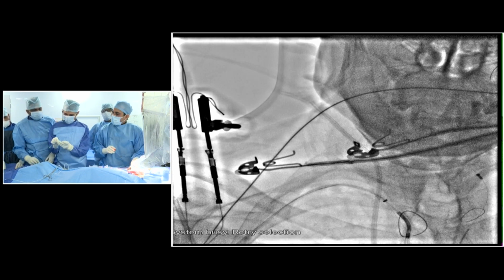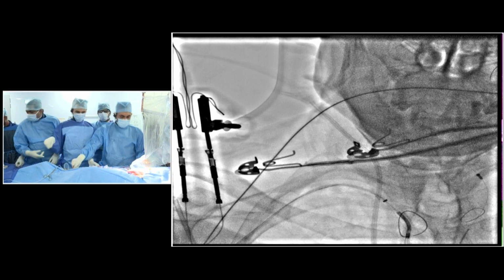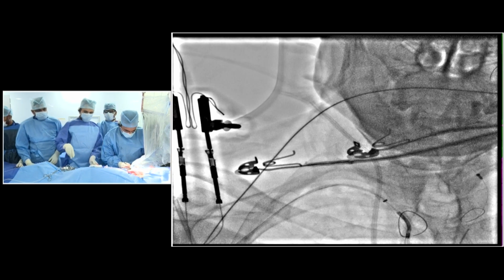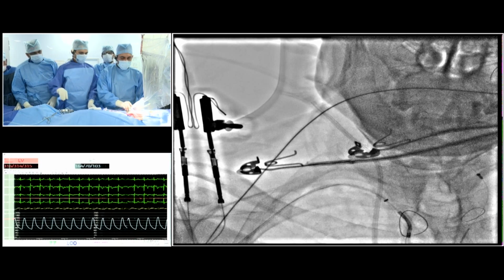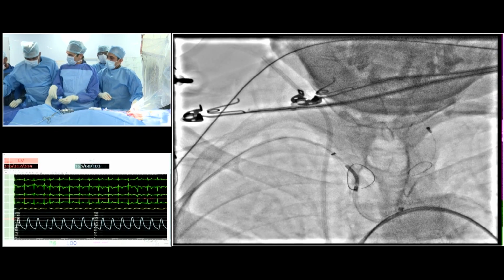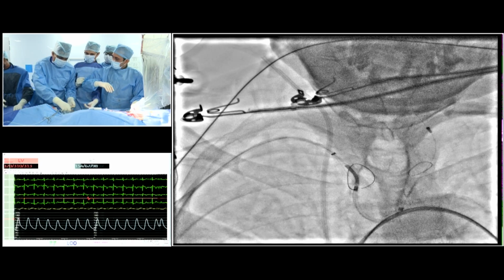And with the complexity of the cases in India with a lot of bicuspid valves, it's a very useful technique, taking into consideration the anatomy, to be able to align the commissure. I'm very impressed by the work, Professor, thank you for highlighting that. It's very well done.